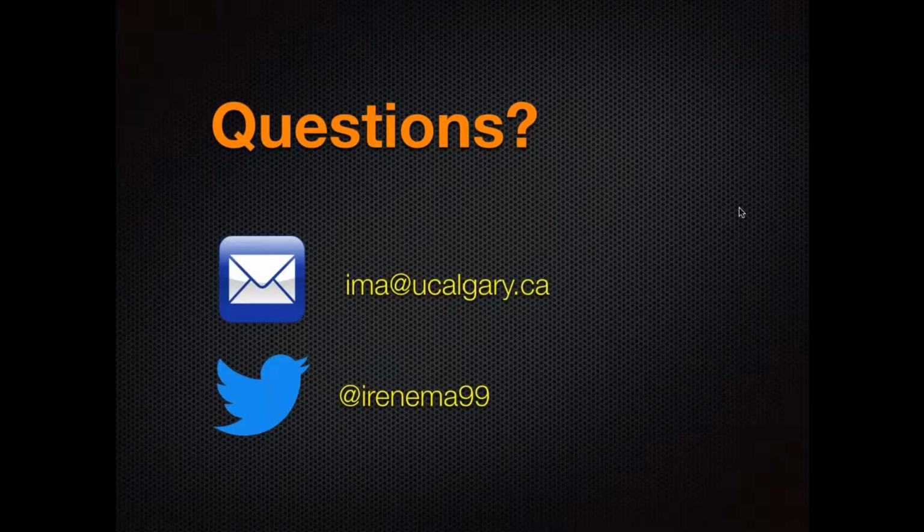Thank you. Sure. Do you recommend any specific resource for a novice internist to learn the basics of the ultrasound machine and the maneuvering of the probes? Yeah, I think there are definitely a number of very good resources out there, and I have no conflict of interest with advertising any of these resources.